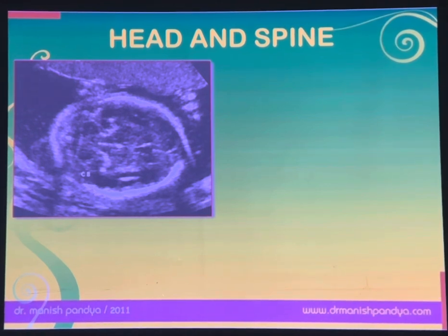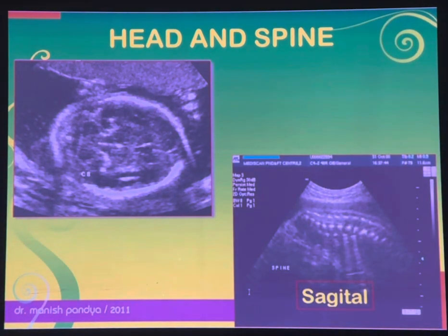And the cerebellum which becomes banana. Another name given to the cerebellar banana is the crash sign. Just like a car is crashing towards the cerebellum, and the cerebellum, which is dumbbell shape, has taken the shape of a banana. So you can call it a crash sign also. So no lemon, no banana. Then you have to see the spine.